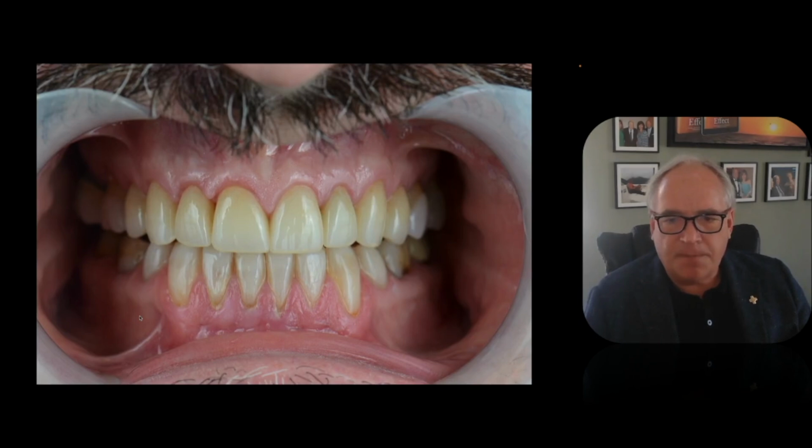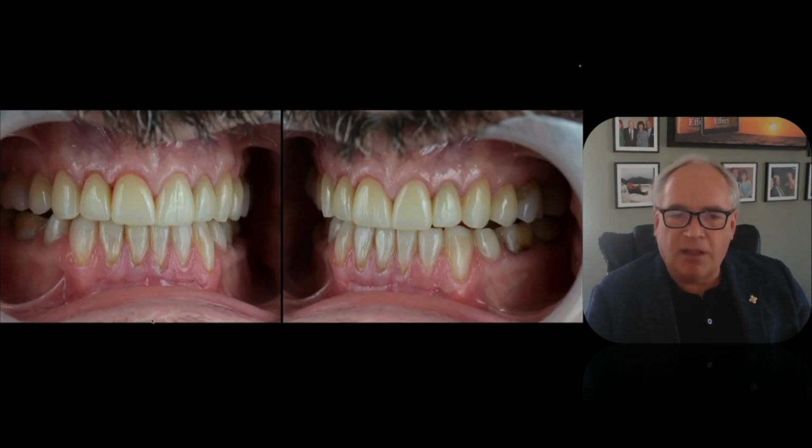And nice looking case. This case, again, was done by Joel at Sculpture Studio. And so Lee is working hand in hand with him, but this is Joel's ceramic work. And this is monolithic from Ivoclar Zircad Prime. So it is a gradient technology that has 3Y, 4Y, 5Y zirconia. So 5Ys on the outside, 3Ys more towards the inside for strength. But all of this, all the color and contour is done with staining and glazing.